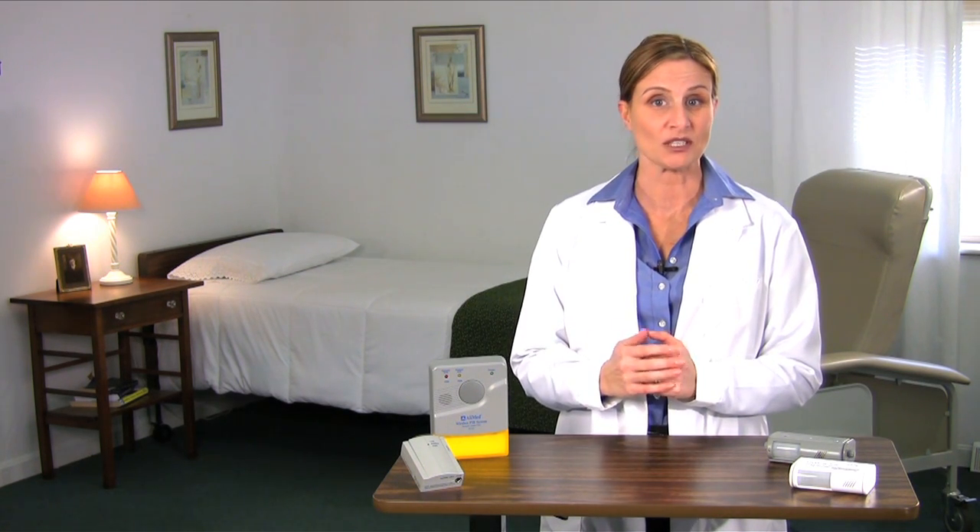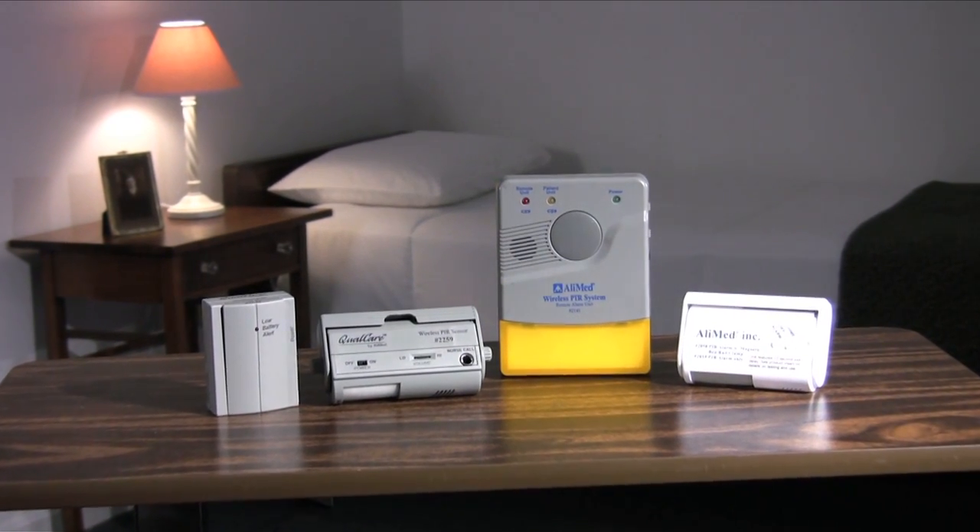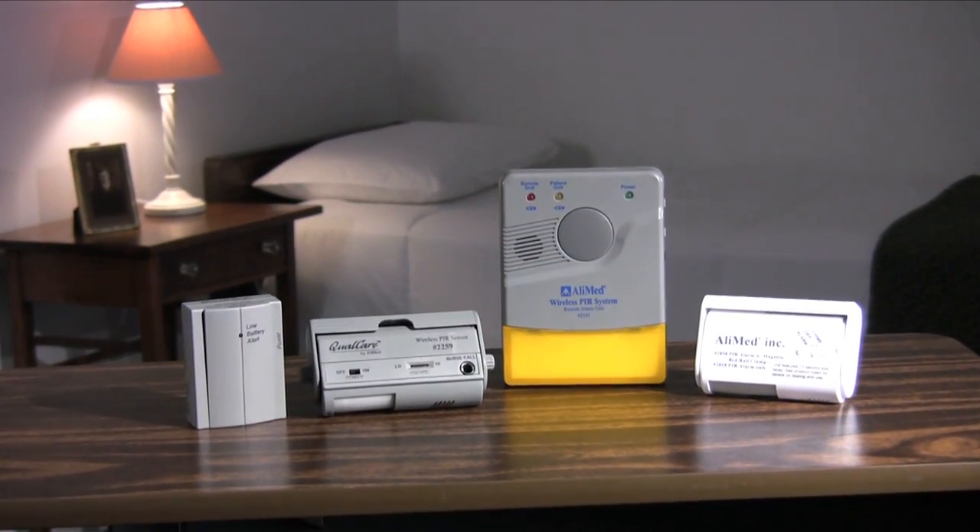This is why we developed the PIR passive infrared motion sensing alarm. You said you wanted a reliable, highly effective alarm that offers earlier warnings and that can monitor patients in bed without cords or wires that get in the way. Well, we have exactly that — a wireless motion sensing alarm that acts as a first alert to patients who are about to rise from their bed.